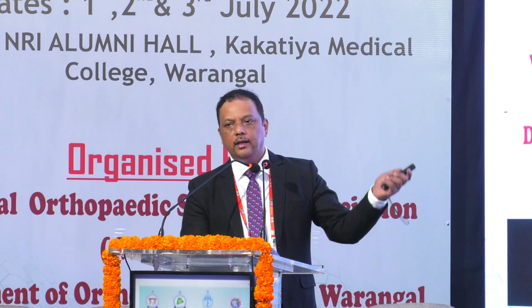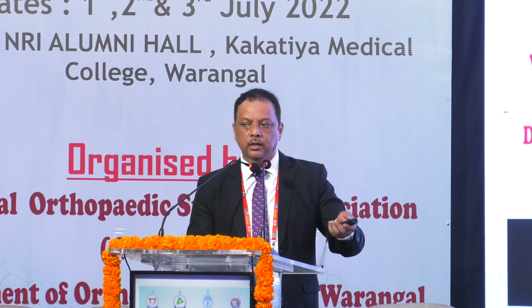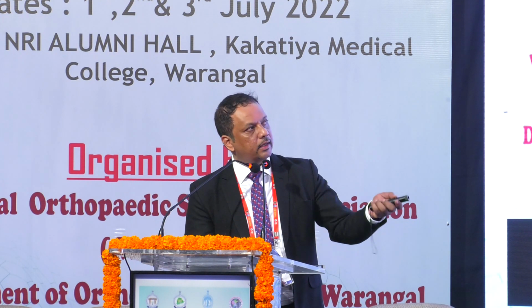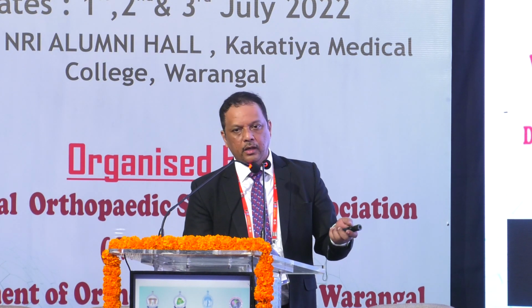So sometimes you can combine your K-wires with your external fixators so that you don't really have to do that amount of distraction. You can pin those small fragments which are not moving separately, use the K-wires as joysticks, fix them, and then you can use your external fixators. You can have the best of both.